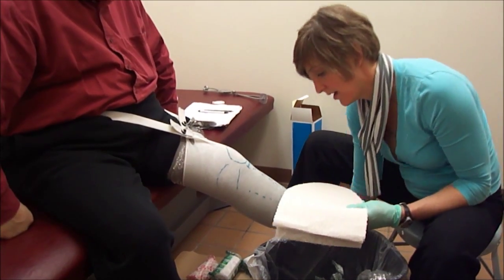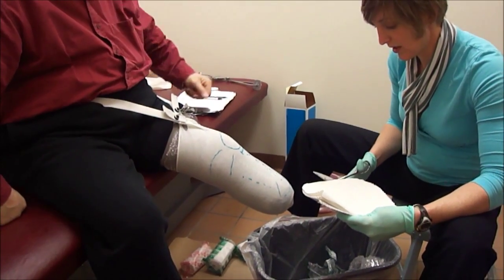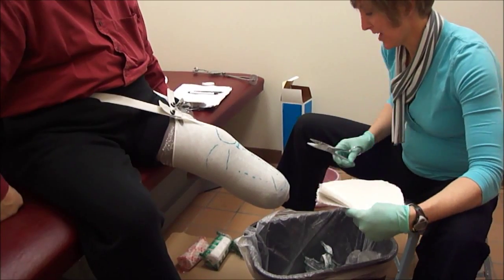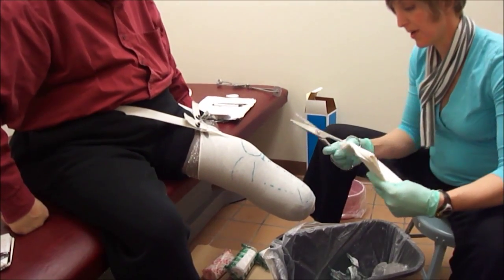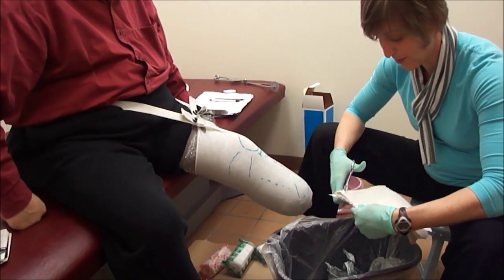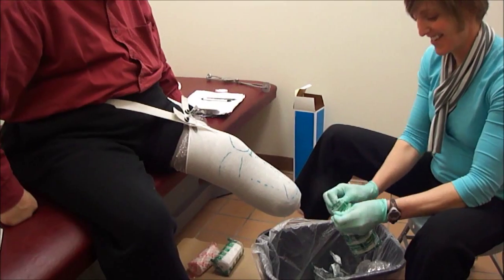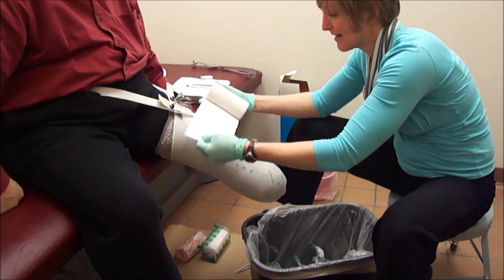A little more up here. You specify what materials you want used and that kind of thing, but a lot of the individual work is done in those plaster modifications. So the more accurate the mold I take, the easier it is for the rest of the process. And there's enough room for a fair amount of human error in all this, but we try to minimize that as best we can.